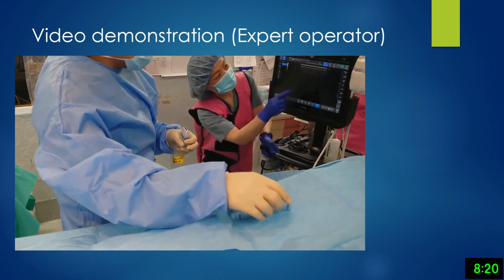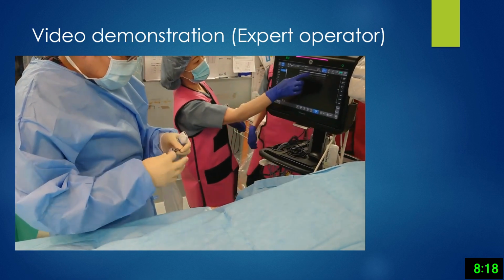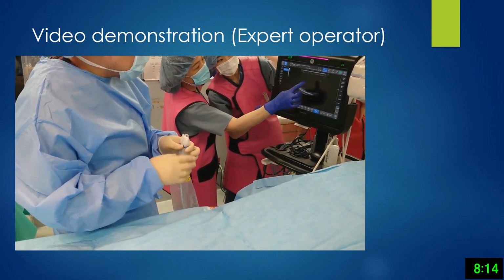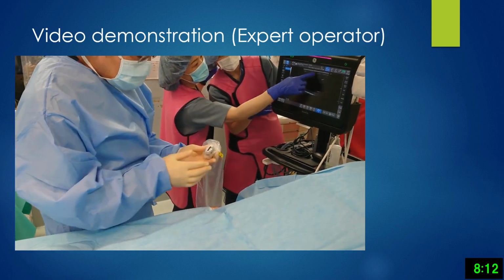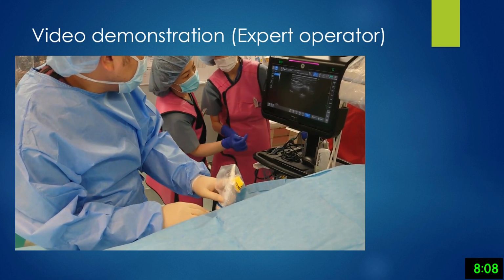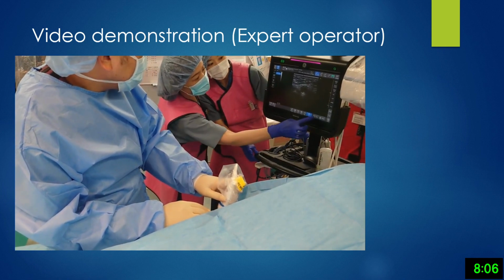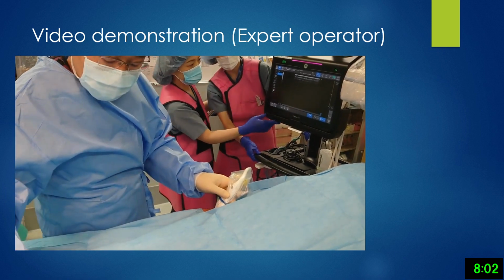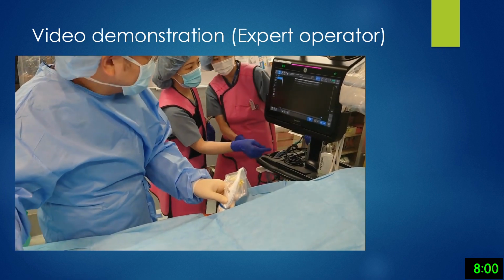She's teaching a younger technician, and he is checking the target artery before puncturing. After local anesthesia, he is puncturing.